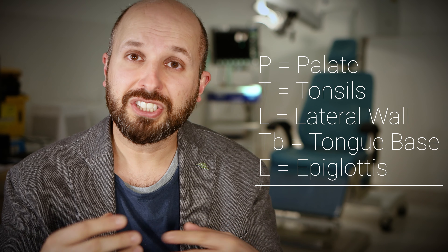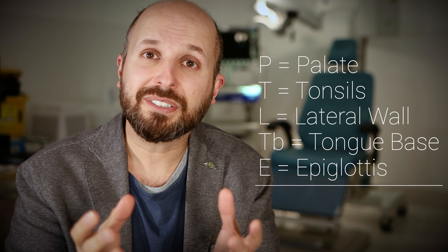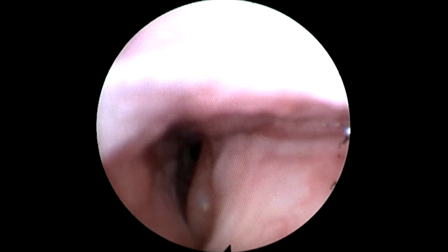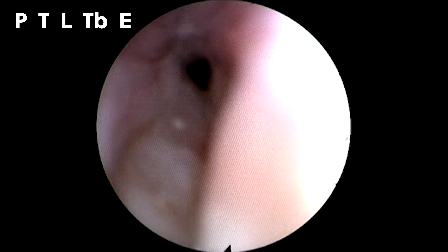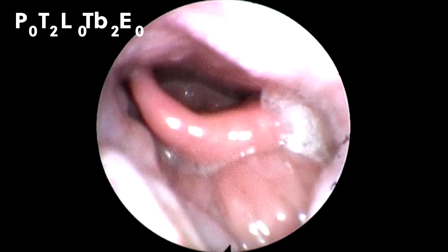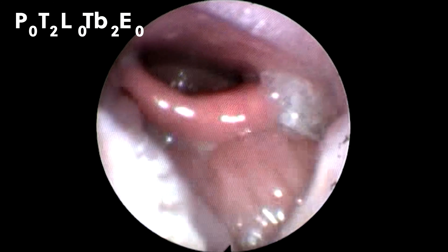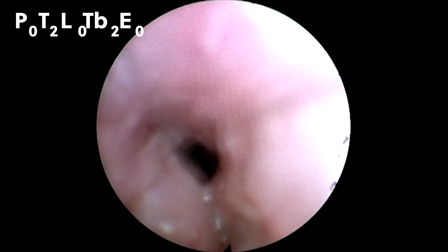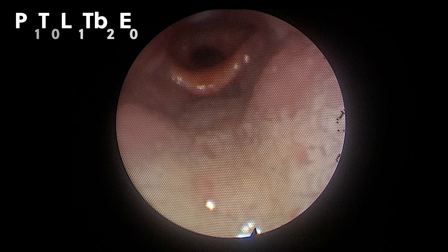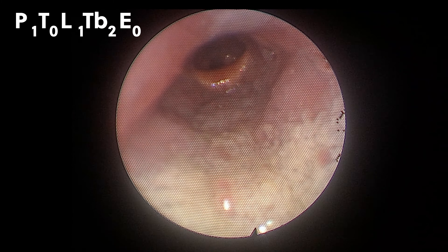Now I'm going to show you some videos almost like a quiz so you can see how the classification works in real life. In the first case, the palate isn't moving at all because the tonsils are in the way and they are huge — definitely T2. The palate is P0 because it's not moving, the lateral wall isn't moving, and the tongue base is very large, pushing back the epiglottis. Although the epiglottis appears to obstruct like a trapdoor, because the tongue base is pushing it back this is E0, not E1. In the second case there are no tonsils — T0. The lateral pharyngeal wall collapses less than 50% — L1 — but the tongue base is causing most of the obstruction: TB2. No epiglottic involvement, so E0.